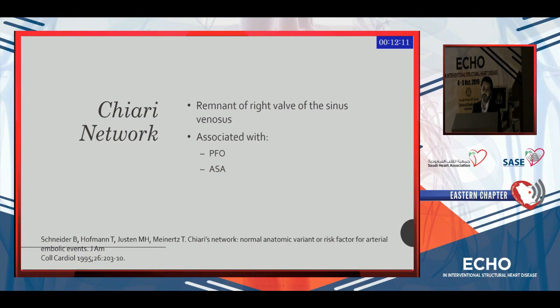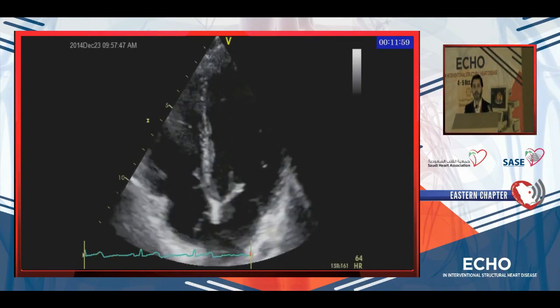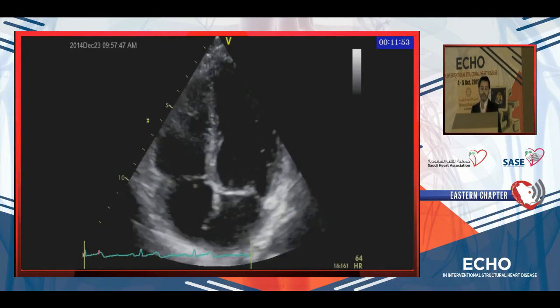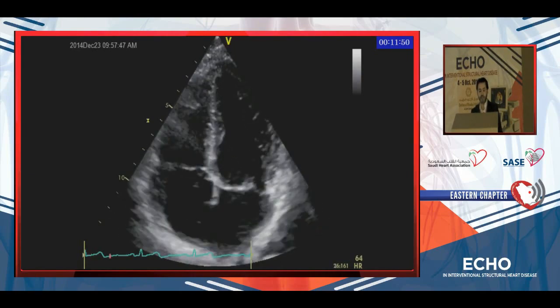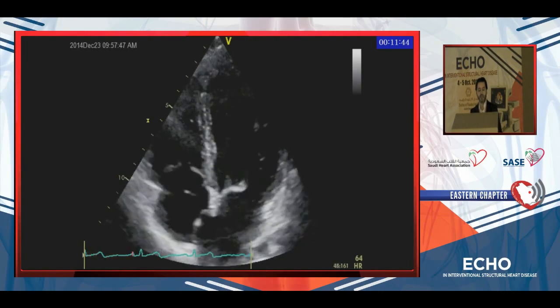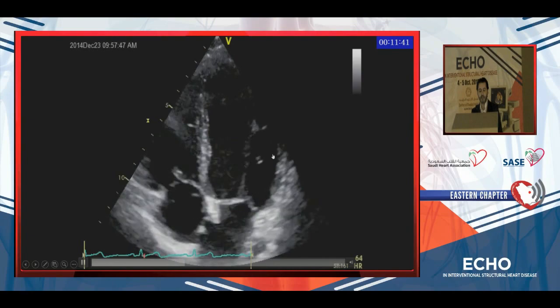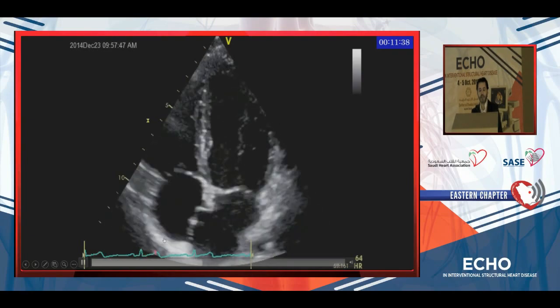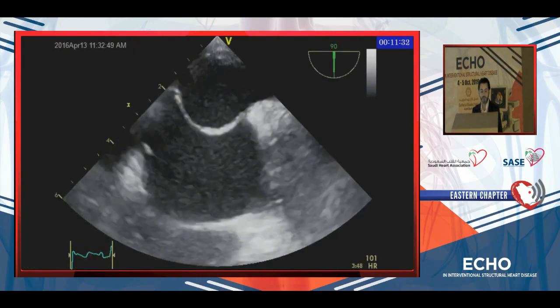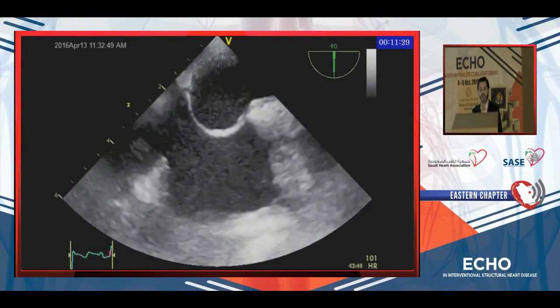What about Chiari network? It is a remnant of the right valve of the sinus venosus. It is associated with the presence of PFO and atrial septal aneurysm. Its presence is important, and for closure purposes it will cause difficulty for the operator. This is an example: if you look at the right atrium you will see a chaotic motion with two attachments — one to the septum and the other near the IVC or Eustachian valve. This is typical of Chiari network. Here again is atrial septal aneurysm with the presence of Chiari network.